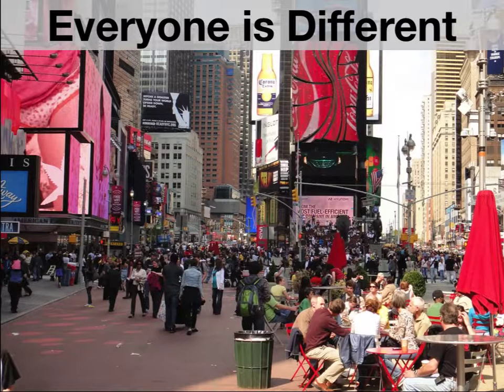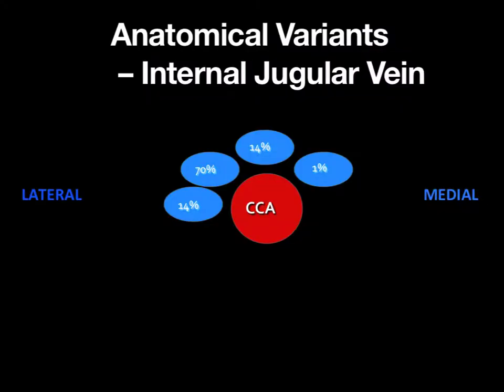Performing a central line using a surface landmark approach, it's important to remember that our technical approach is going to be guided by anatomic generalities, but everyone is different, and this is what's going to potentially lead to problems. So let's take a look at some anatomic variants in terms of the internal jugular vein and common carotid artery relationship.